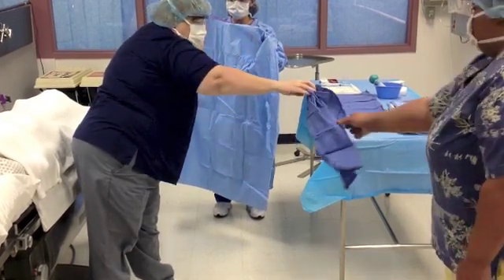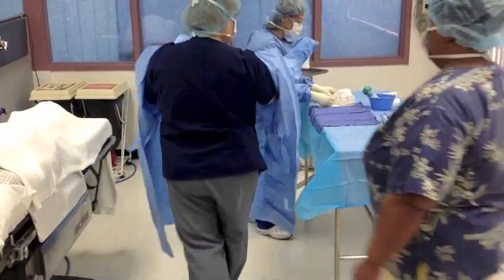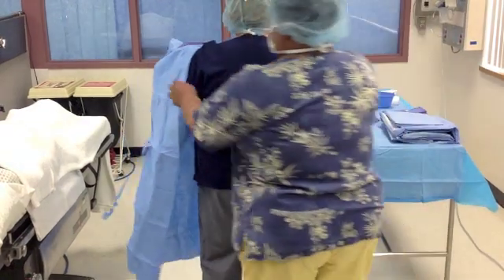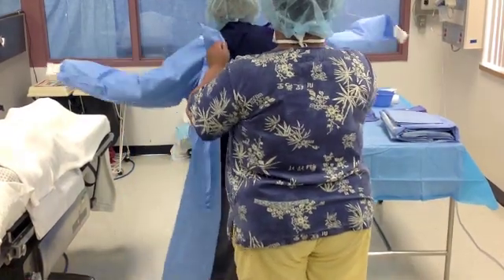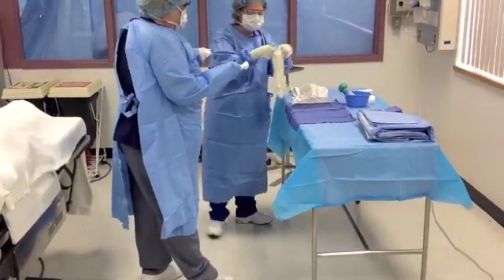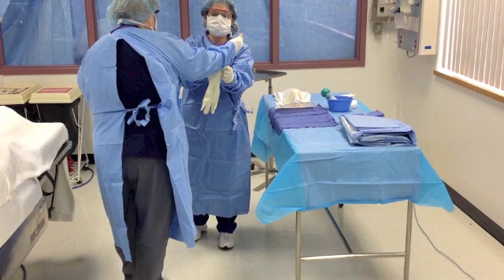Position the gown so that the person you are gowning can easily insert his or her hands into the armholes. As the surgeon inserts his or her arms into the armholes, push the gown past their elbow and up to their shoulders — let go and step back. After determining which hand is to be gloved first, remove it from the glove package. An additional step that may be necessary is to assist the surgeon in pulling back his or her sleeve to expose their hands. To do this gently, grasp the blue sleeve and tug towards the elbow until their hand is exposed.